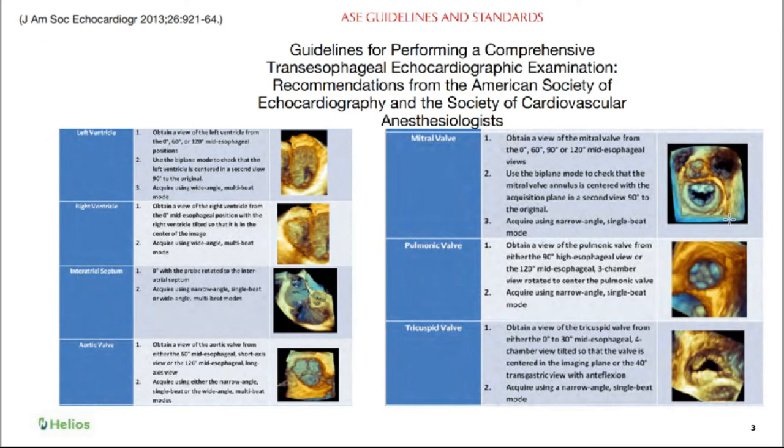So then, before these guidelines came out, when we with Annette in 2010 wrote a review on 3D for anesthesia and analgesia, we wanted to display the 3D data sets. We went to our surgeon and asked, how do you see this structure? How do you see this other structure? And try to present the 3D block just like the surgeon sees them, because we thought that the surgical orientation was the correct one.